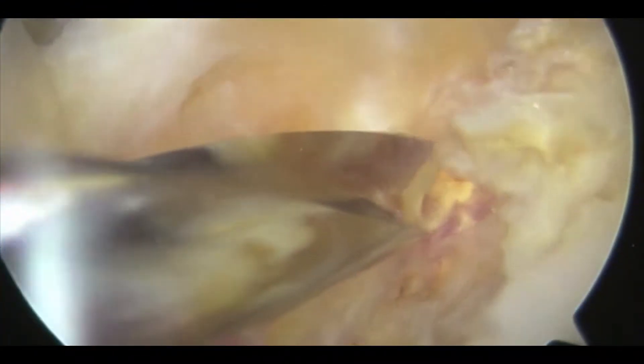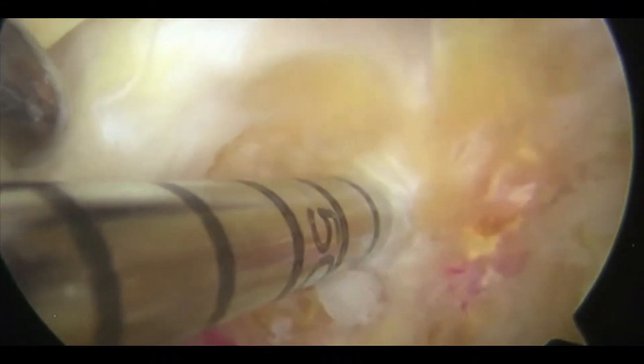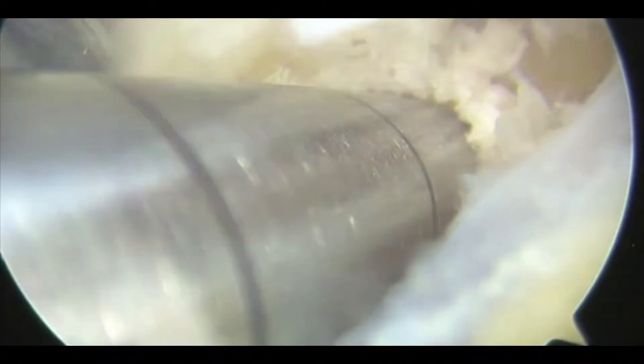We can see the groove. We're going to use a biceptor technique. This is the guide drill that's going to be drilled into the position where we want our tenodesis, drilled down to about 45 mm. This is going to be over-drilled by a 7 mm drill down to about 35 mm to create our tenodesis socket. That's been prepared.